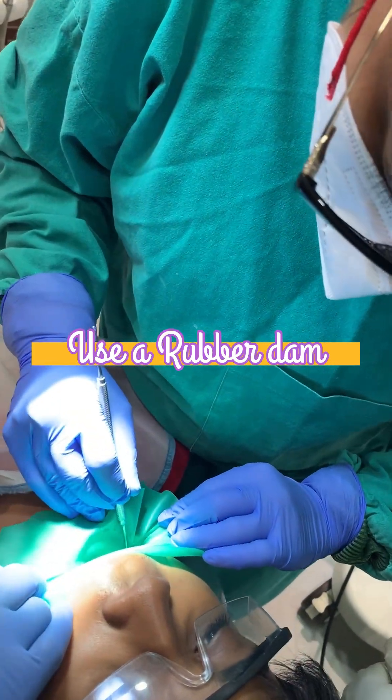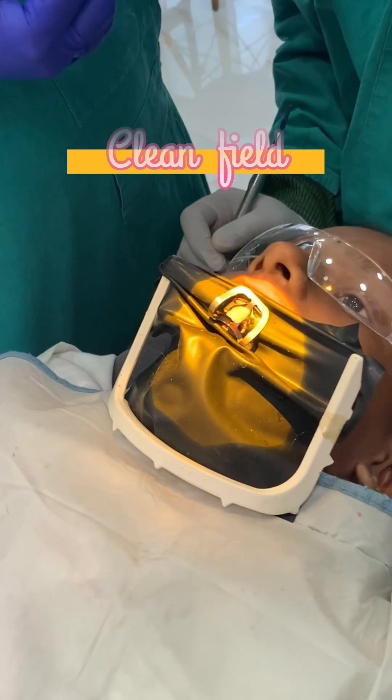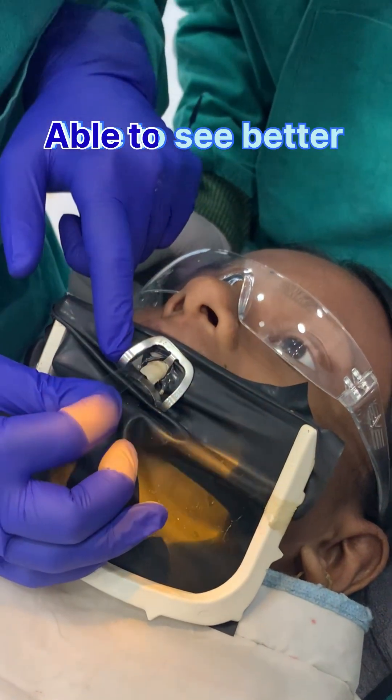Rubber dam will move cheeks and tongue, so you will get a clean field plus your cheeks will not come in the way, and you will obviously be able to see better.